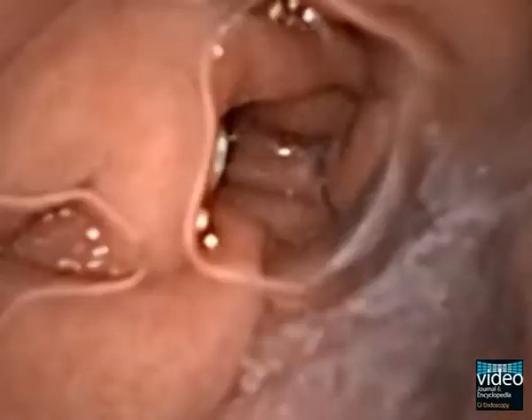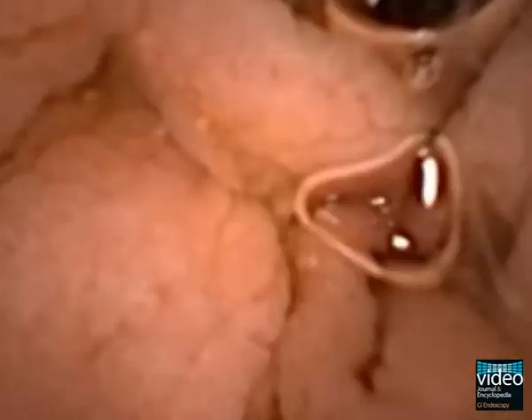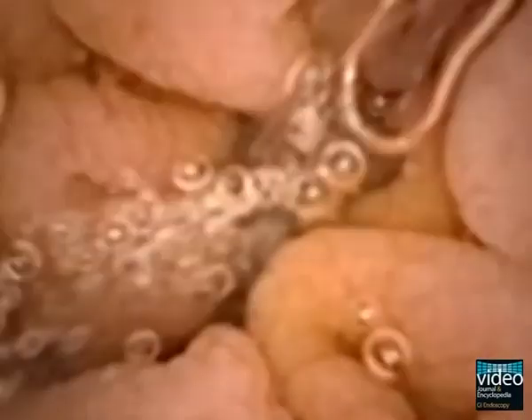This is a case of a 32-year-old female patient with severe malnutrition and diarrhoea. The capsule endoscope is passing the pylorus. The descending duodenum is rapidly traversed, and bile is seen within the lumen.